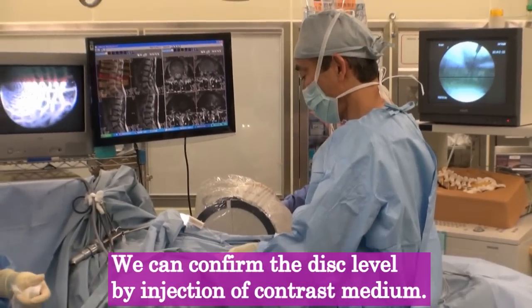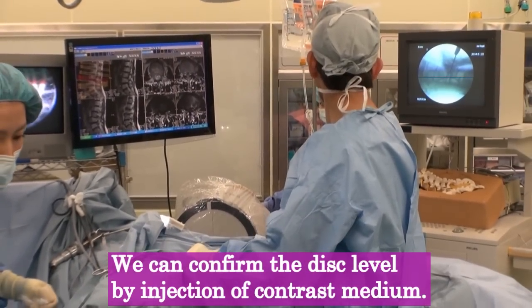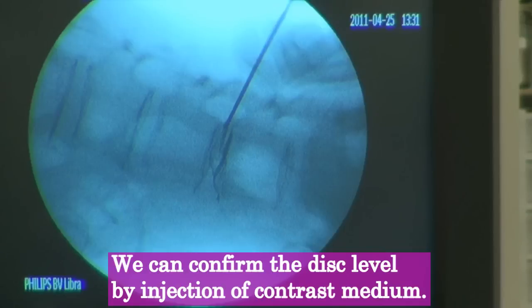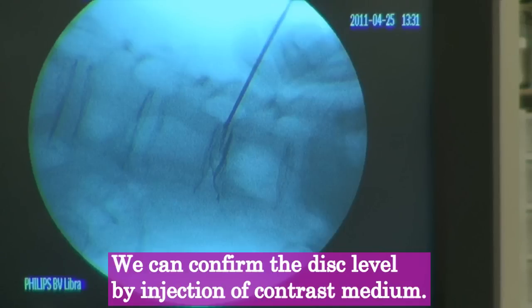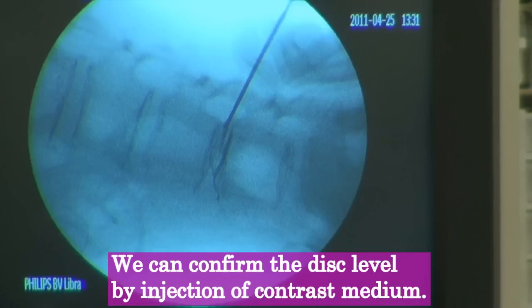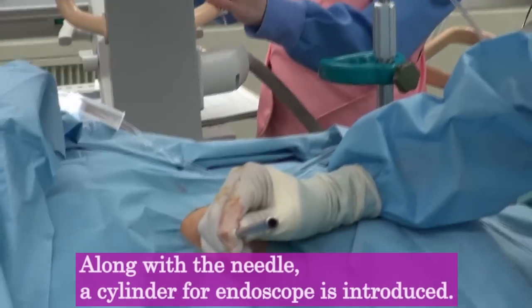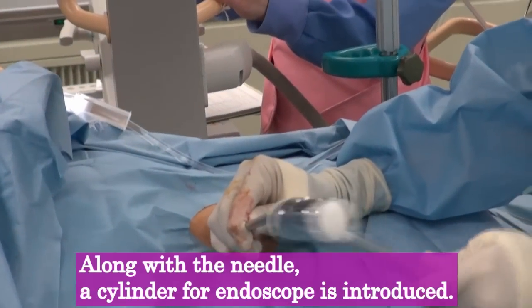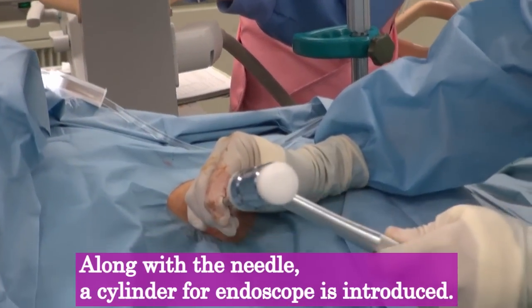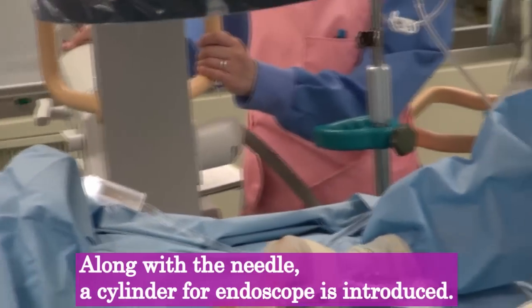Contrast medium containing indigo carmine is injected. We can confirm the spread of contrast medium at the L3-4 disc level. Along with the needle, a cylinder for the endoscope is then introduced.